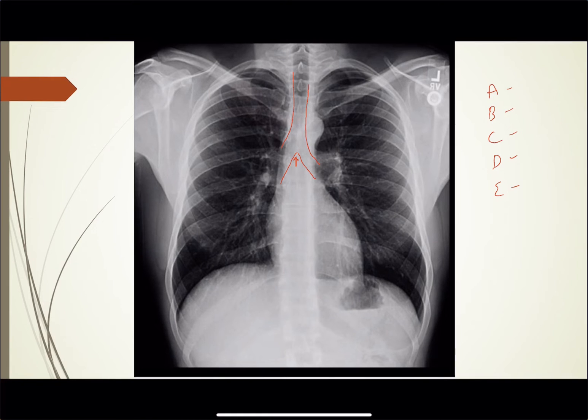That covers A. B — we're going to look at the bones: clavicles, ribs, shoulders, vertebrae. C for cardiac silhouette — we can see the cardiac silhouette coming down here, looks nice and normal. You can see the lung markings through the cardiac silhouette.